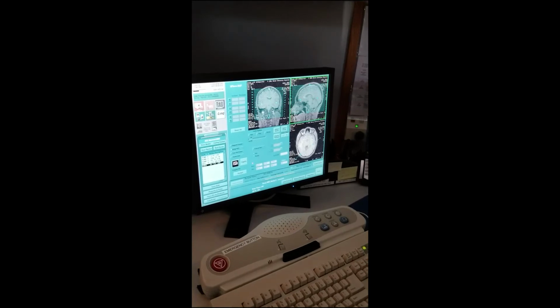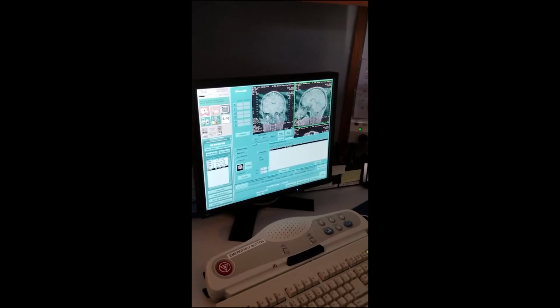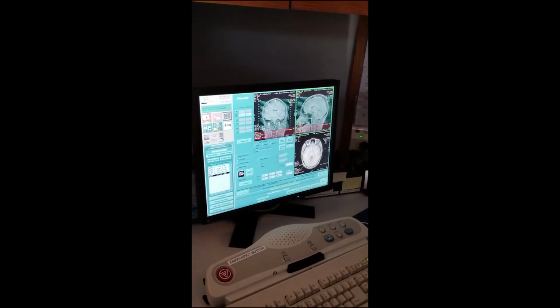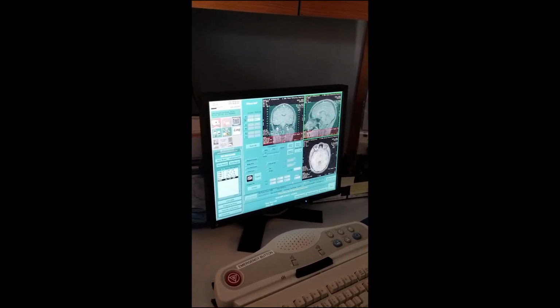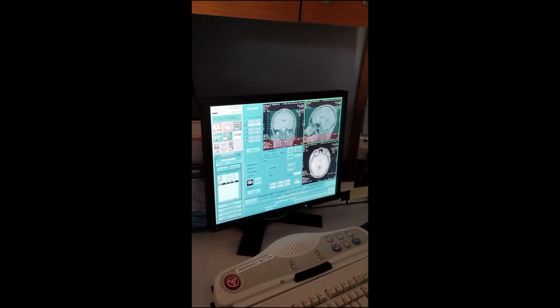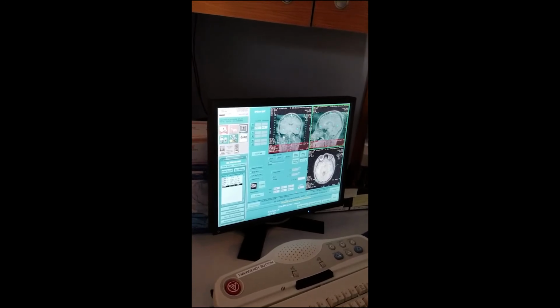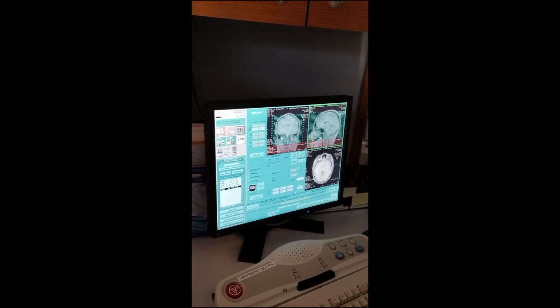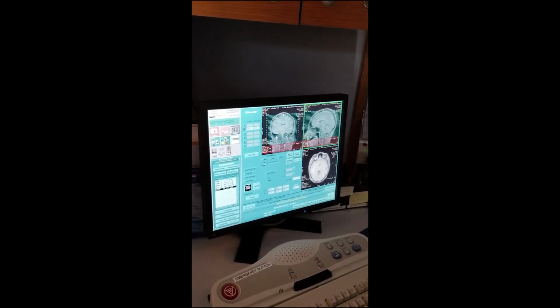Do you need to turn it on and off for one of them? No, when you copy, everything needs to be off. And I said accept. The only thing I want you to learn here is that if T2 axial was 4 millimeter and gradient axial is 3 millimeters or 3.5 millimeter, you cannot copy. You understand? It has to be 100% the same. So accept.